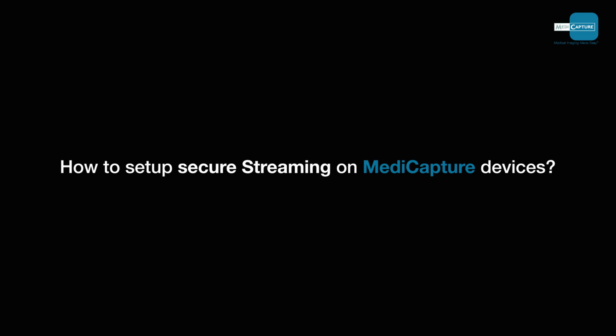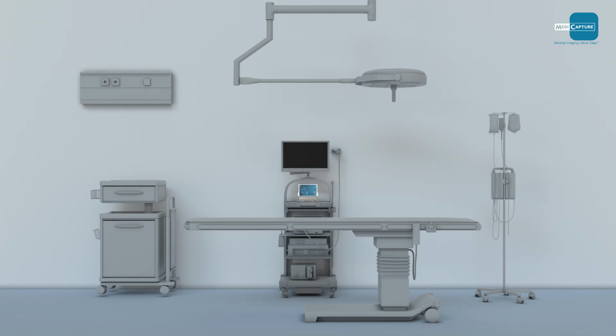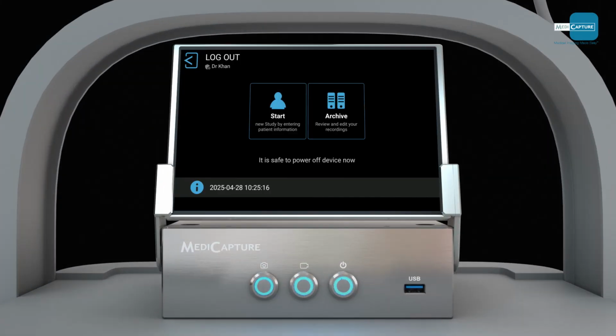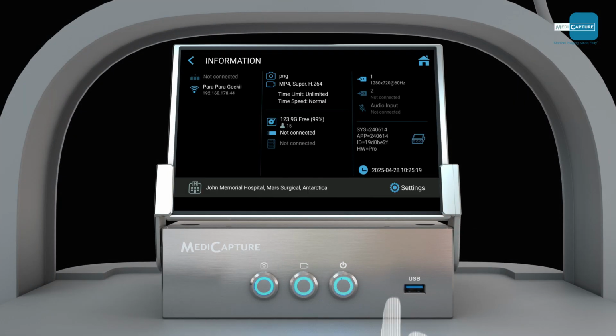In this short video, we'll set up live, secure streaming from your MediCapture recorder and archiving system. Start by pressing the Info button, then choose Settings.